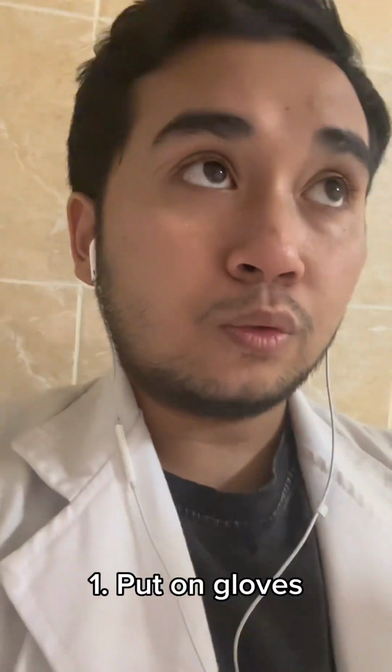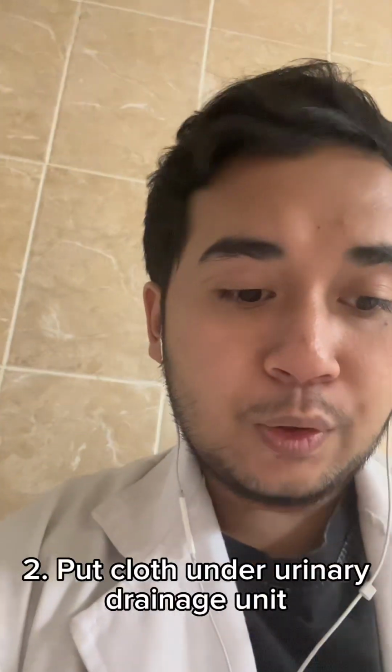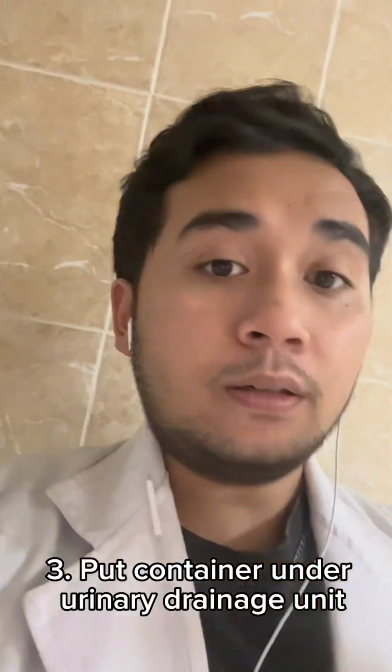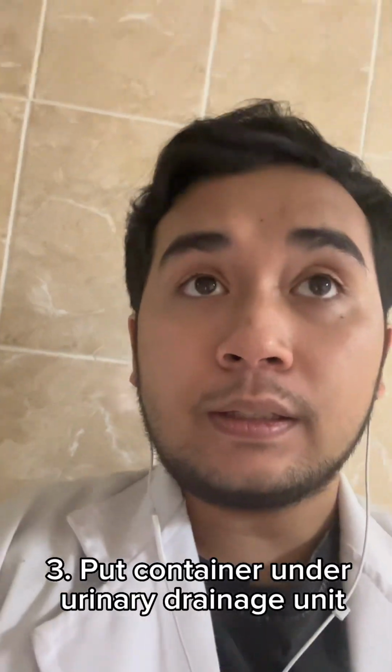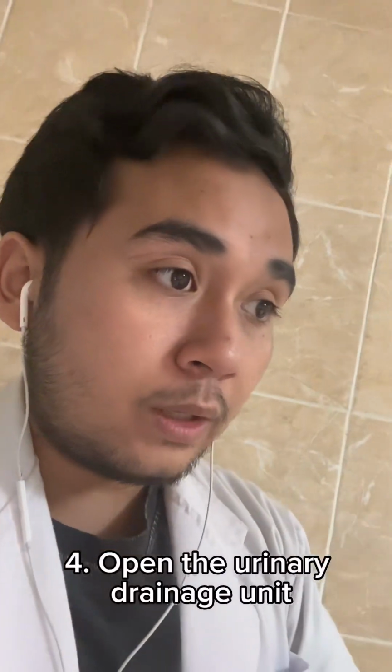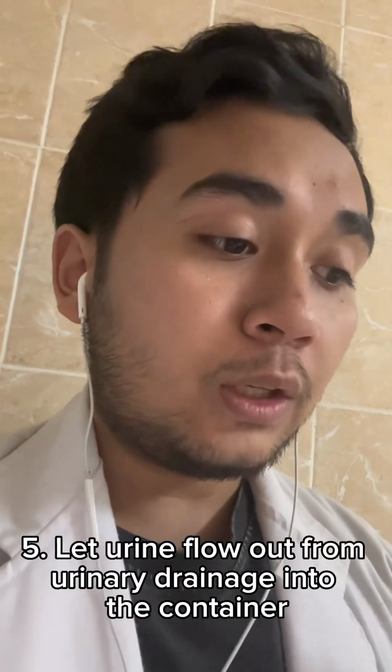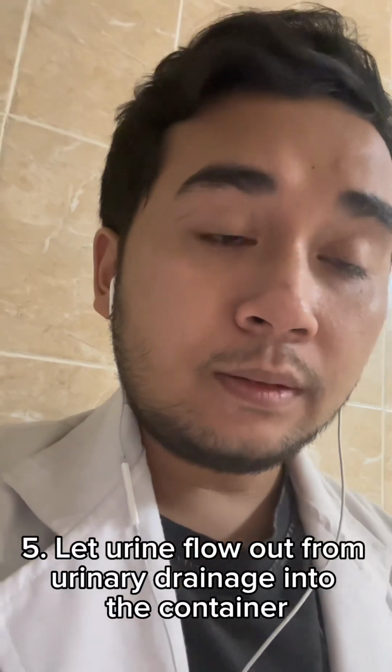First, the procedure. First, you put on your gloves, of course, because we want to avoid infection from the urine. Then we put a cloth under the urinary drainage on the floor, and we take the container and put it under the urinary drainage. At the urinary drainage, we have a drain outlet, and we have to open it. After we open it, we slowly let the urine flow out from the urinary drainage into the container until the urinary drainage is empty.